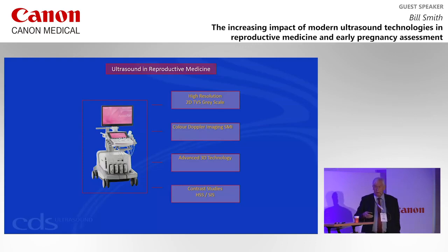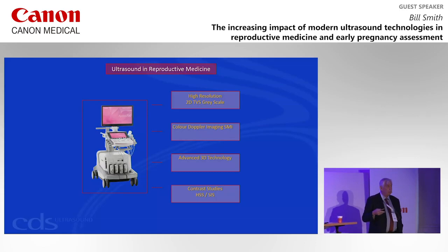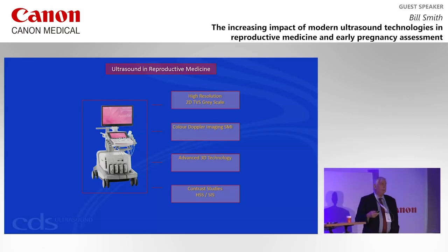I think that comment certainly applies to whichever facility we're looking at. So in the brief time I've got, I'll go through these different areas and talk about what our machines are capable of giving us, both in terms of diagnostic effectiveness as well as influence on clinical management.